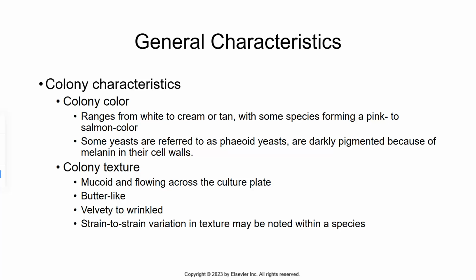There are a few that are encapsulated and they look perfectly round, but for the most part they're going to be larger in general, so it's kind of easy to differentiate yeast from bacteria in a microscope when you get used to looking at the different organisms.